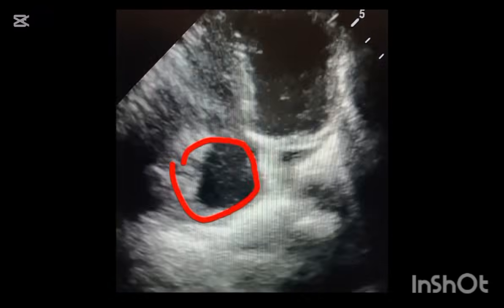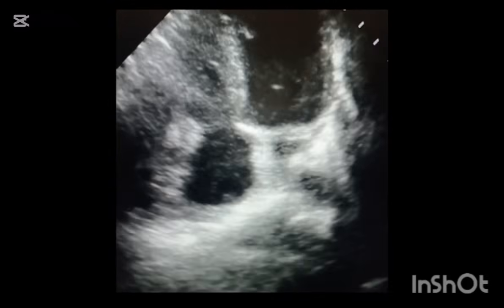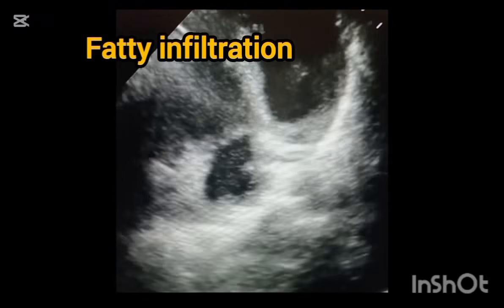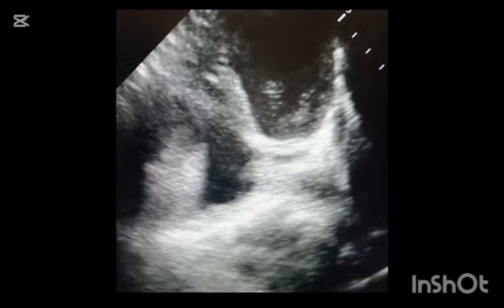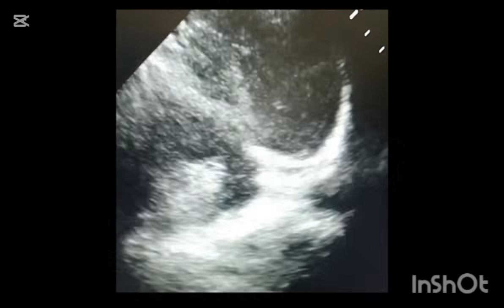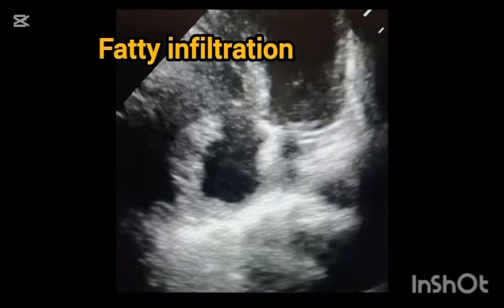Look at this image, you will observe a round mass-like structure at the tricuspid annulus. This is called fatty infiltration around the tricuspid valve annulus, which is often confused with a mass or tumor. So this is a normal variant, not a pathological structure.